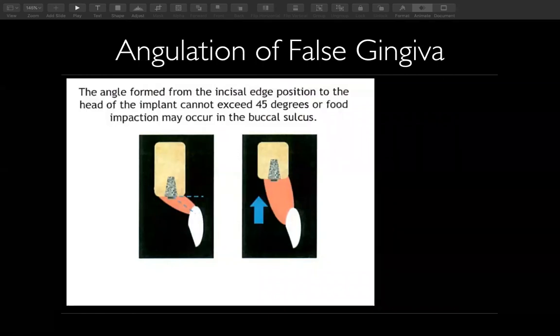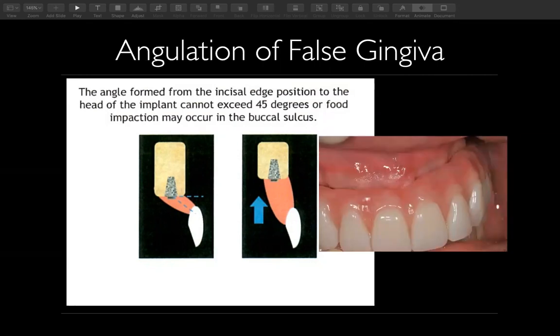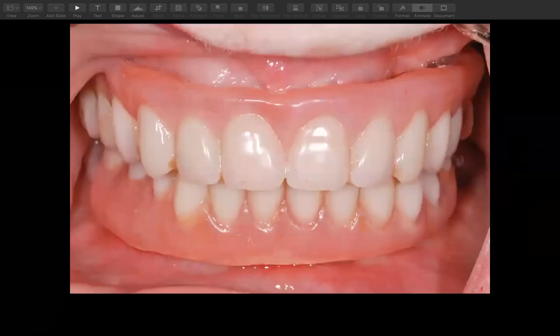It's going to create a shelf. The patient's lips will get stuck up on the edge there. When they eat food, food will get caught up on there. We want to keep it as minimal as possible. So again, we're at the mercy of where the bone was reduced, where the tissue is, and where the denture teeth are placed for esthetics and their bite. We want to contour and shape that acrylic as best we can to not create a shelf or a flange. This is typically what you'd like to get.